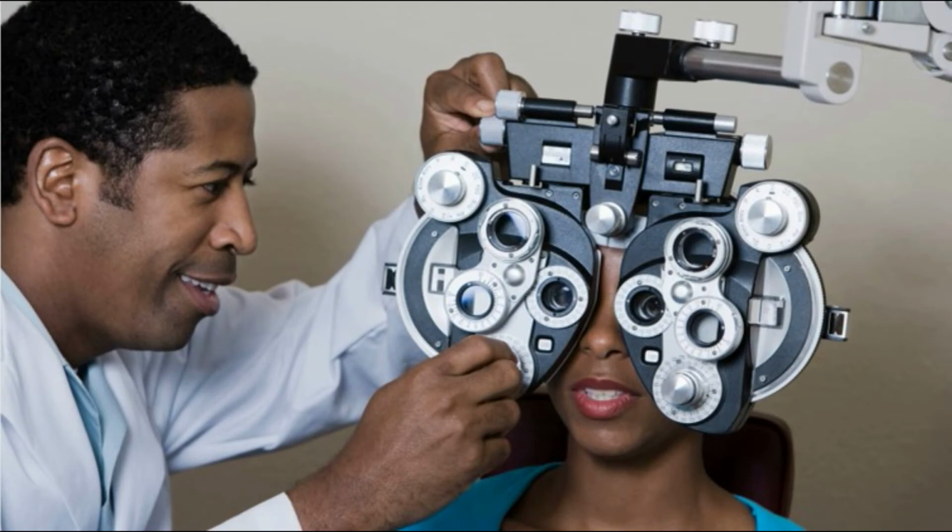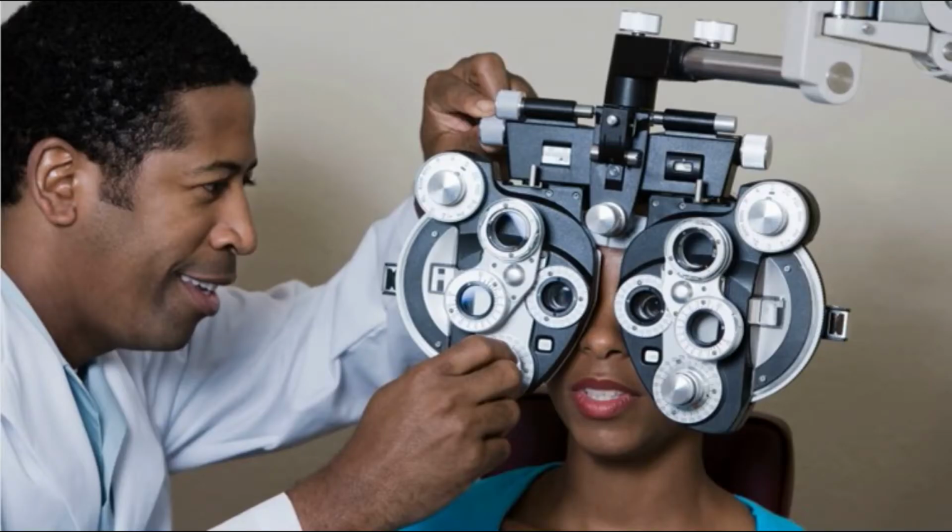So what is refraction? It is simply determining the refractive state of an eye in a patient you suspect to have refractive error, or as a general checkup of the patient. Remember, all patients require objective refraction. We have two main types of doing this. The first is subjective refraction, and this is by subjectively determining the combination of either the spheres or the cylinders necessary to provide the best visual acuity for a patient. It means you have to rely on the patient's feedback to get the best results. So if patients are not able to give feedback, then this might not be a good idea.